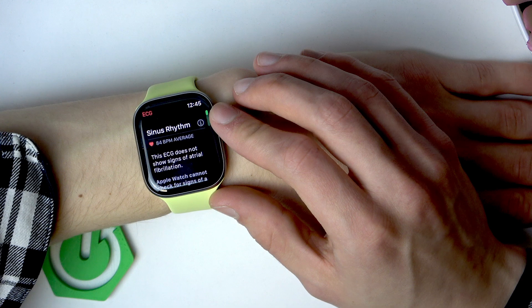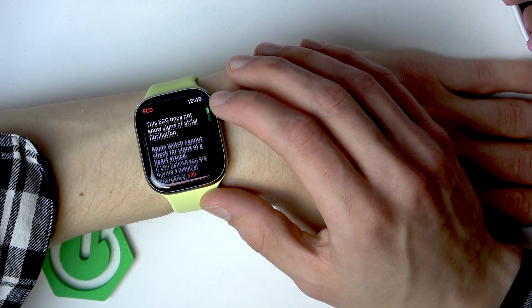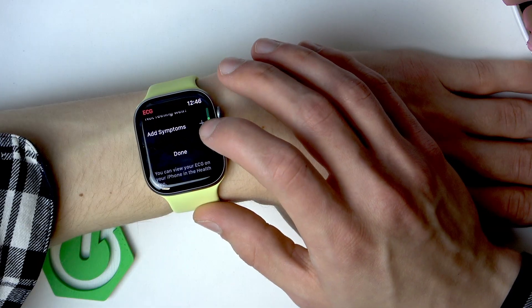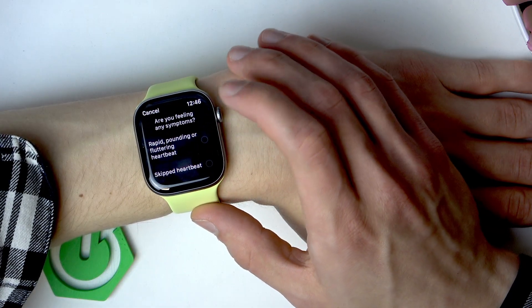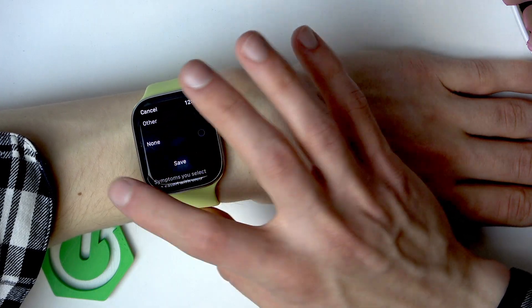And right now you can see the results of the test. You can also add additional symptoms below by tapping the plus icon next to 'Add Symptoms,' and then select the symptoms that you feel at the moment.